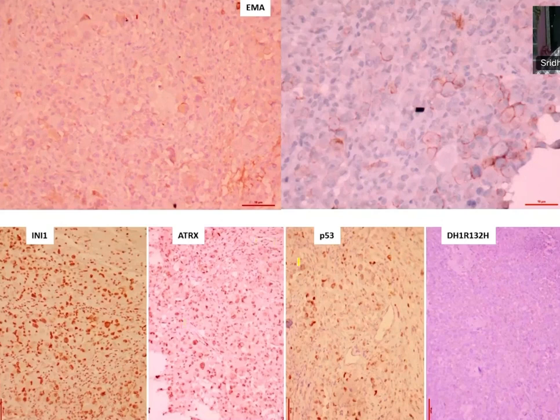Anywhere across any body, whenever you have an epithelioid phenotype, you get EMA positivity. It does not tell you anything. Don't jump to a conclusion of an ependymoma on EMA positivity. EMA membranous positivity is not a feature of ependymoma. Membranous positivity only tells you about epithelioid morphology.